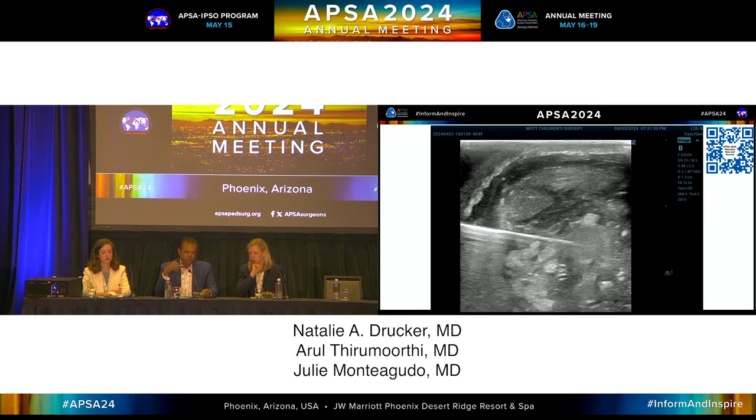Your needle will get pushed out. This is probably an experience we've all had, where you're trying to pass the wire because you think you're in, but really you're hoping you're in. And you can get the needle better seated before you pass the wire. And that's really important in these kids, because you often only get one shot before you have too much hematoma or spasm.